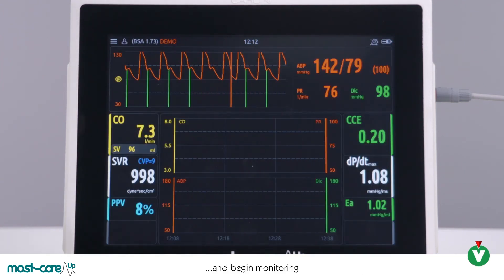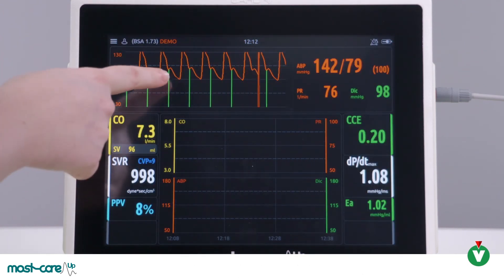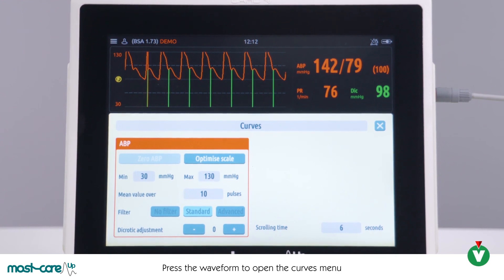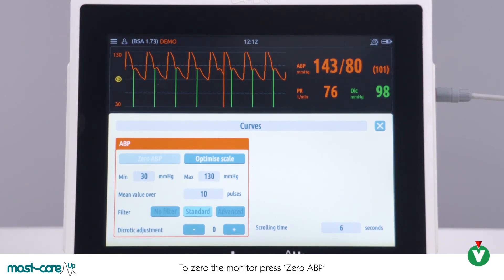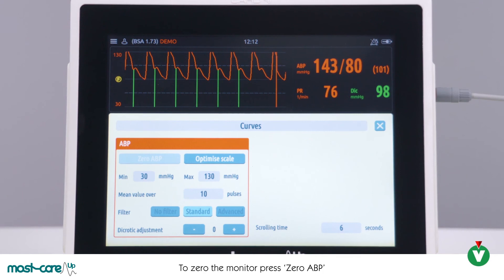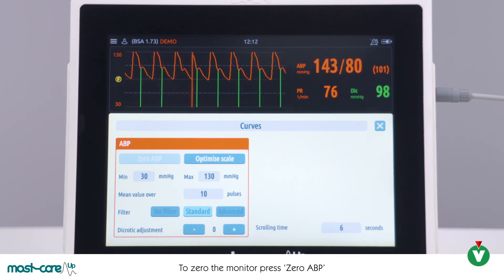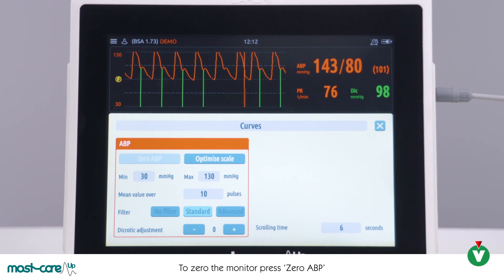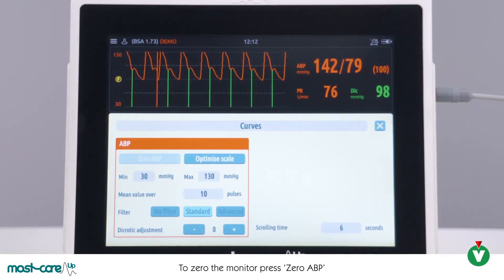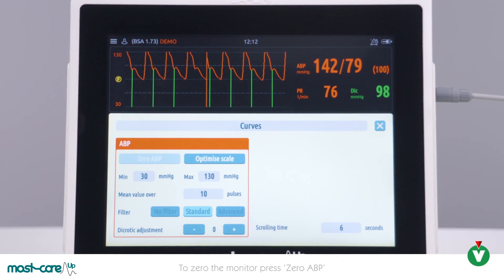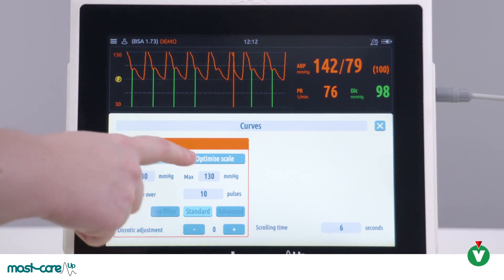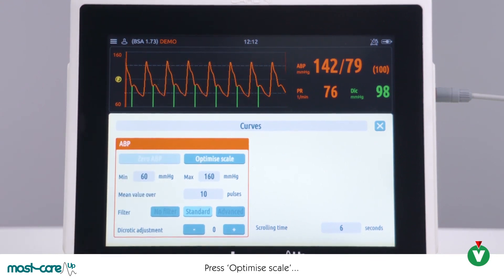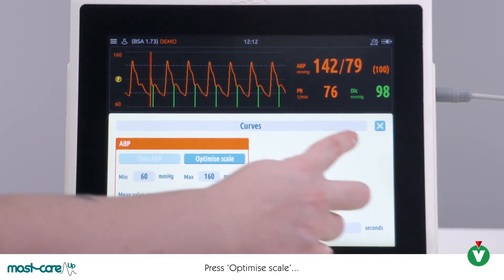Once on the monitoring screen, click on the waveform box to open the curve screen. Open the arterial line to atmospheric pressure in the usual way and press zero ABP. It's good practice to also zero the patient monitor at the same time. Re-establish the arterial transducer and optimize the scale if required. Press X to return to monitoring.